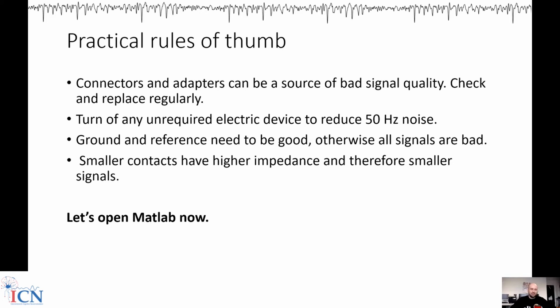So in addition, during the visualization of your recordings, if you primarily see the reference, you don't know if you actually record anything from your contact of choice. But that's also true if you use an LFP channel. I think it's a whole philosophical thing that you can go into, and you can always ask me or Esther how we feel about certain setups. I think we are both open-minded and thinking, depending on what exactly you want to achieve, there's a good way forward.